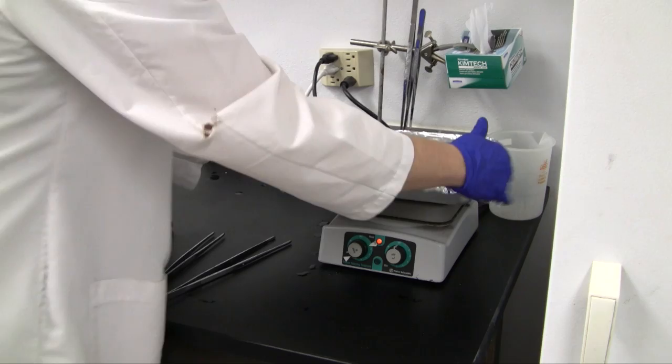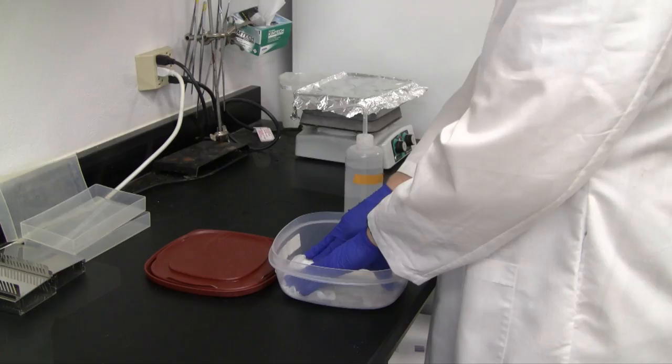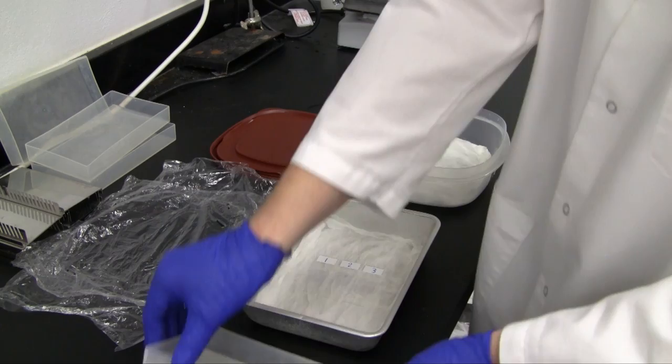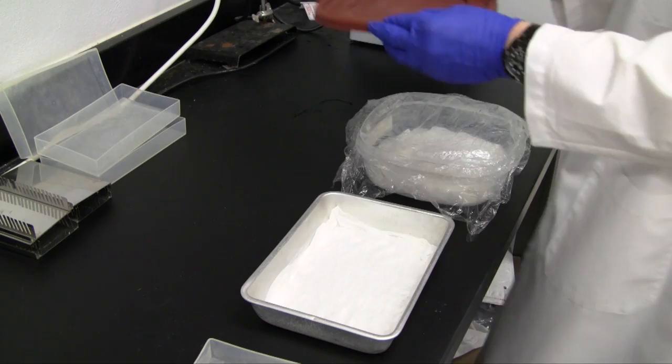While the slides are boiling, a humid chamber is prepared by placing chem wipes into an airtight container and spraying with water. After the slides have finished boiling, the pan is removed from the water bath. During this step, care is taken to avoid steam burns, and the plastic lid is removed in a manner that prevents condensed water from dripping on the slides. The slides are transferred to the prepared humid chamber and the chamber tightly closed. Plastic wrap may be used to ensure an airtight seal.